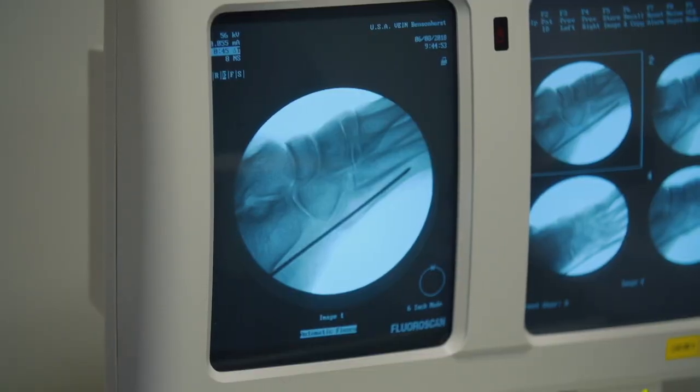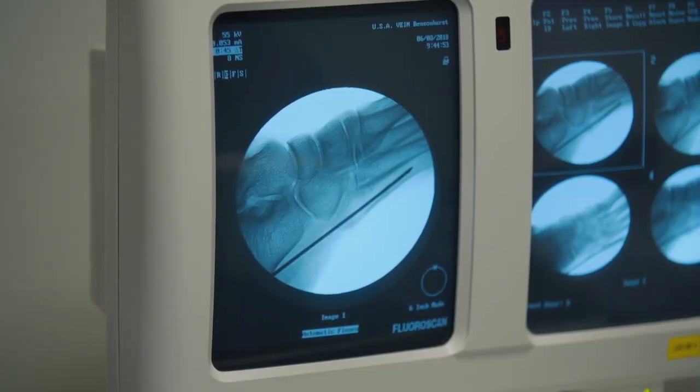So here we've obtained a lateral after the initial placement of the guide wire. We look good in the transverse plane, but we're probably riding a little low on the fifth metatarsal. So now we can utilize our parallel positioning guide. We'll place that over the first wire, and then we'll utilize the slot just dorsal or superior to that first wire, which makes adjustment that much easier.